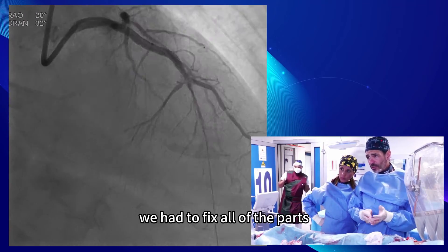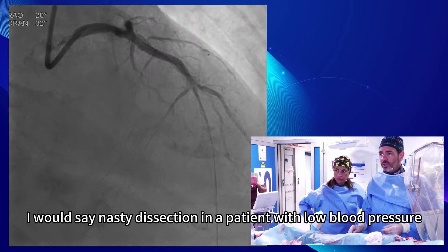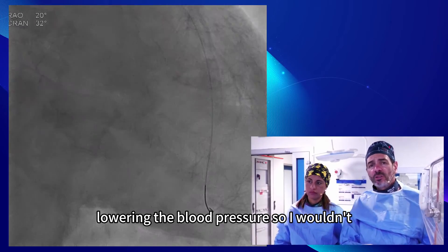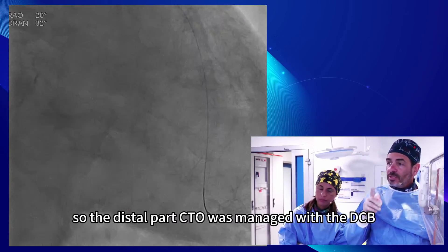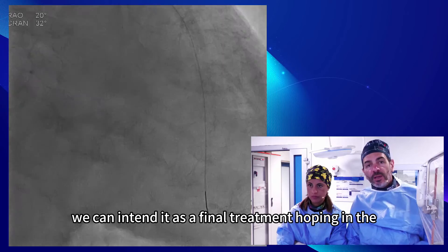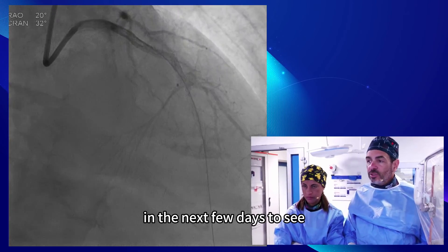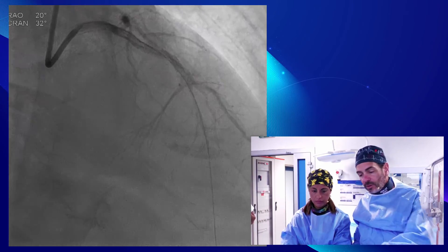Unfortunately, we had to stent all of the part treated with DCB because of a nasty dissection in a patient with low blood pressure and on adrenaline. During weaning, blood pressure could drop further, so I would not be happy leaving this type of dissection untreated. The distal part — the CTO — was managed with a DCB, which we can consider either a final treatment hoping for positive remodeling, or an investment procedure, since this patient will still need to be treated for the RCA.